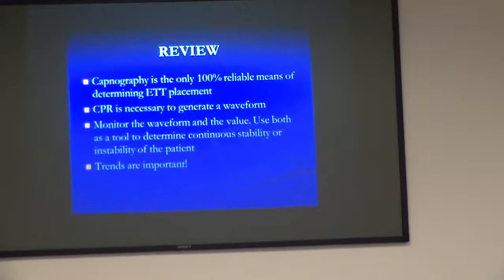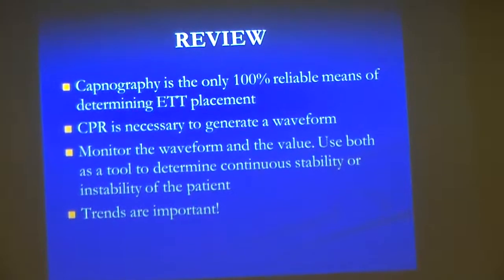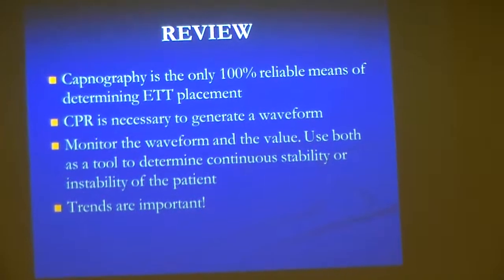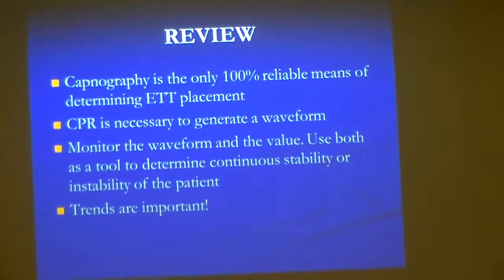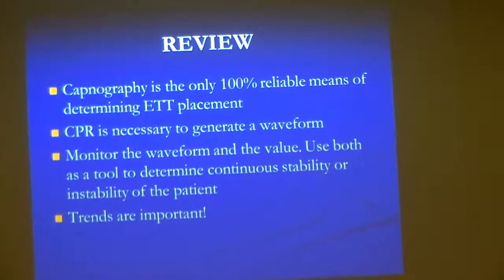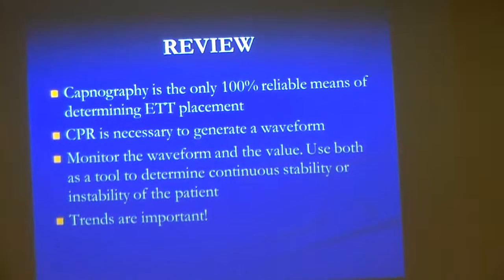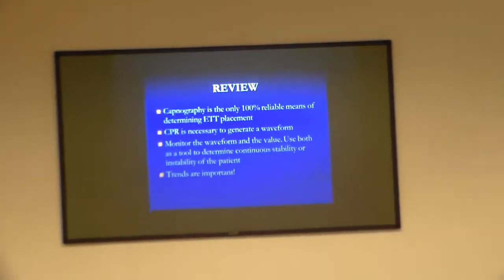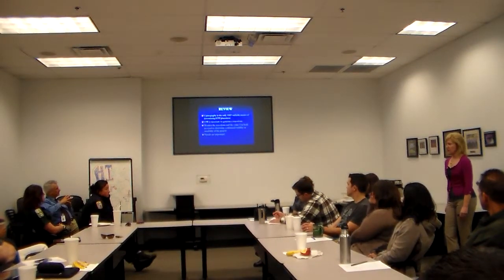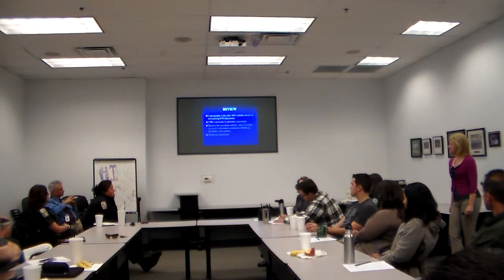Trending is important. Remember to document your end-tidal CO2, so those numbers go up next time we ever talk about this that Jess shared. And it's mandatory now, so we need to make sure we document our end-tidal CO2 on our PCR, make a strip, check your tube before and after, and document your end-tidal CO2s before and after you move your patient. That way, in court later on, they're not going to say, well, that tube wasn't in. You're like, look, when I gave care, this was my end-tidal CO2 on that patient. And it's documented, and you have a waveform to prove it.